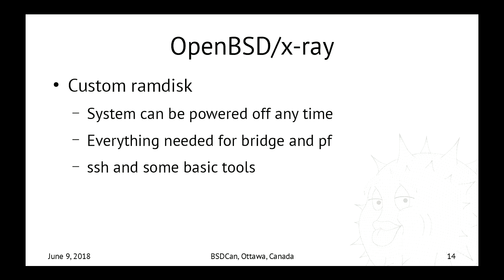And the way they set this up, it is a custom RAM disk, which is a design choice that I somewhat question, but at the same time I understand. Because especially when we talk about the compact mobile units, they are often being used in areas that have very little infrastructure and frequent power outages. So basically, these boxes can lose power anytime. And as I mentioned, the cost of fixing stuff there is very, very, very high.